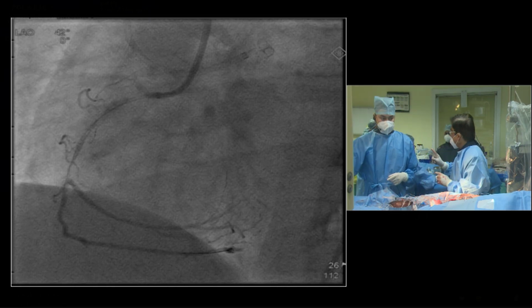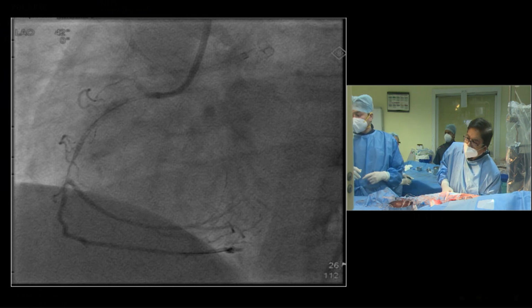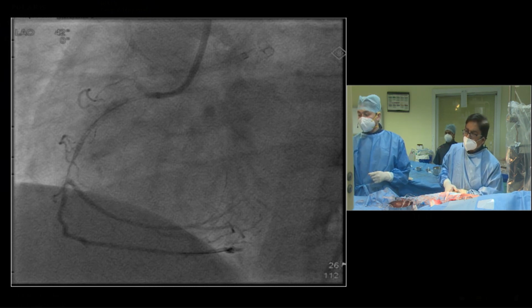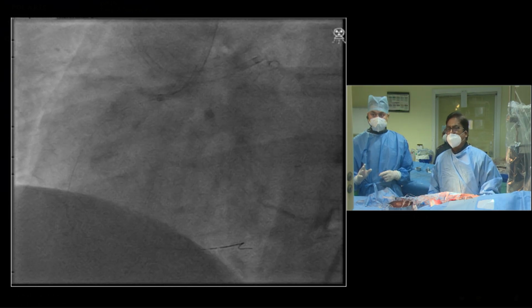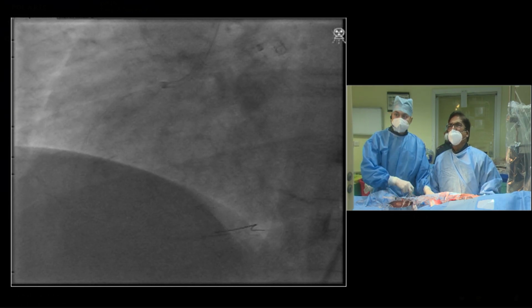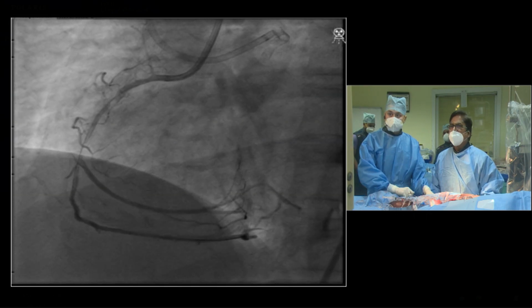You don't have a crusade? I think you can give some fluid. No, he wanted to demonstrate if there is no possibility. I know that he will easily cross to the side branch immediately, but he just wanted to demonstrate how a crusade can be used properly.